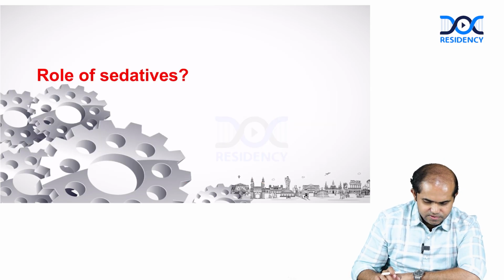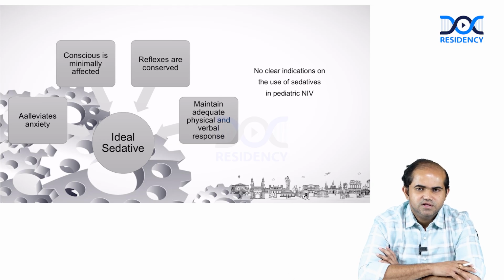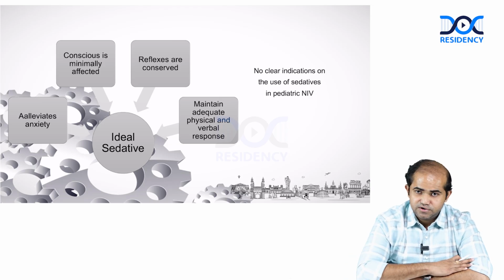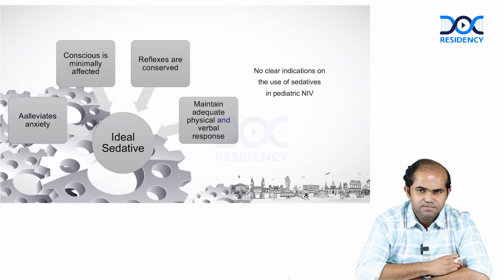Any role of sedatives? Usually we don't use them, as I said previously. The child's airway should be maintained, GCS should be good, and hemodynamic stability should be there whenever you start a child on NIV. So what is the ideal sedative? Usually whenever you put the child on NIV, the child is not going to tolerate it. Definitely, because if you put an infant or a neonate on CPAP, with bubbling for maintaining constant airway pressure, the child will be very restless and irritable.